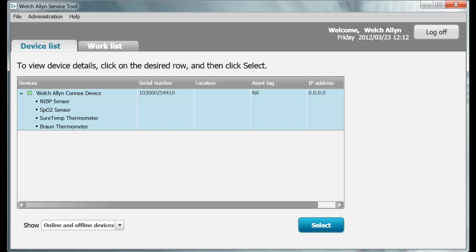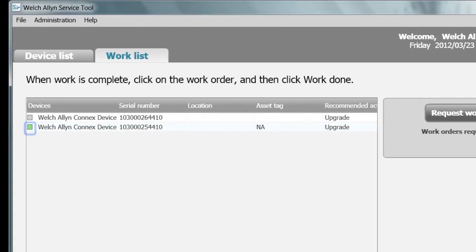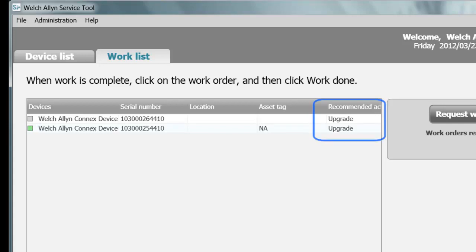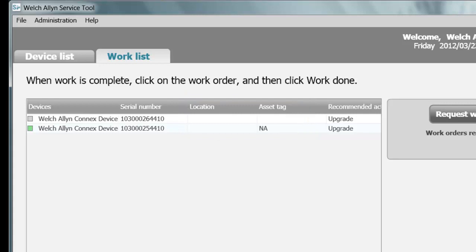When you click the Work List tab, you will see devices which need upgrades or updates, have licensable features available, or require maintenance such as calibration. A gray box indicates a device that is maintained but not connected to the Service Tool. Once connected, Welch Allen can notify technical staff that a device is due for calibration or a software upgrade, or that a licensable feature is available. The Work List also shows the asset tag and location of the device, helping technical staff know where the device is when work needs to be performed.